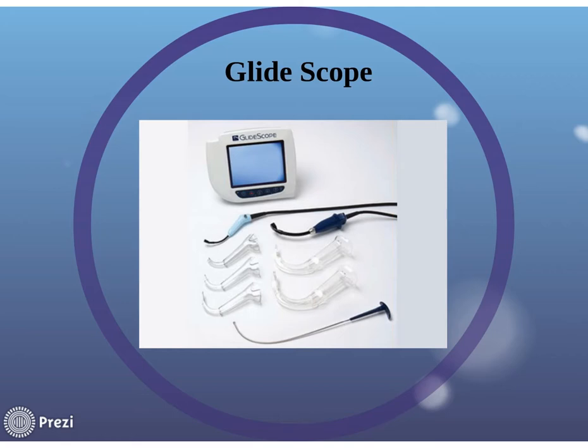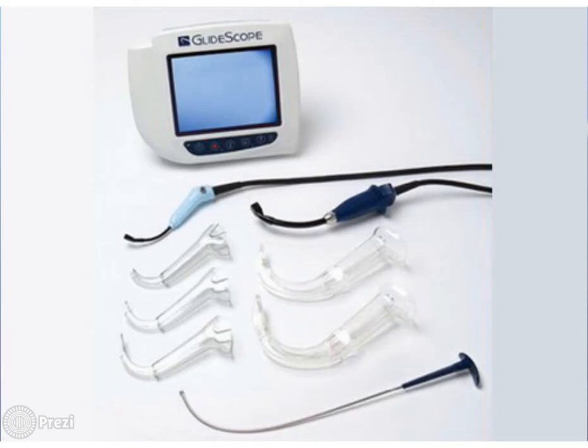What's this called? It is a stylet specifically. It's called the rigid stylet. Rigid as opposed to the other ones you will see that are a lot more flexible. And when we use the GlideScope or CMAC or McGrath, a lot of times people will require you to use these. Put a little bit of lube on a 4x4 gauze, and then I usually just run it along here so it's lubricated. And I always test it to make sure it goes in and out of the tube easily. Nothing's worse than when you've got the tube in, you're trying to pull out the stylet, and it's really hard to get out. So I always lubricate it just a little bit to make it a little easier. But that's a rigid stylet. And there are techniques that go along with how to use that too. Yes, we got the close-up view of that.